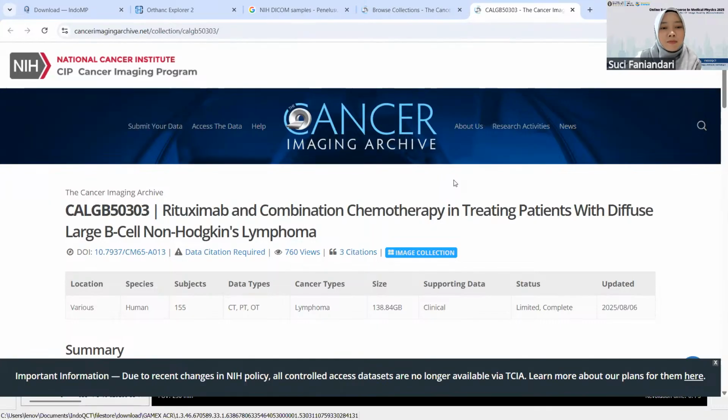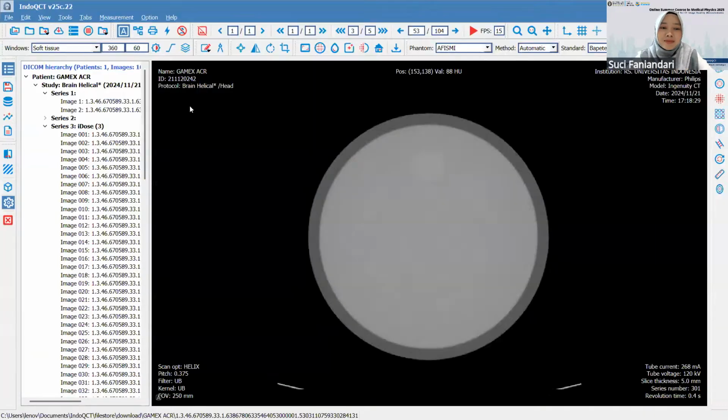And I think it depends also. In our environment, in our university, in our lab, we don't have a commercial Orthanc system. So we have to save many DICOM files in our local hard drive, and open them as usual images via this button: open images, open folder, or add DICOM. So this is the standard open procedure in our research environment.